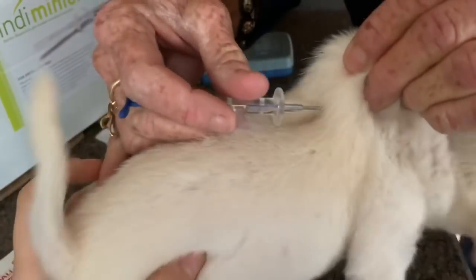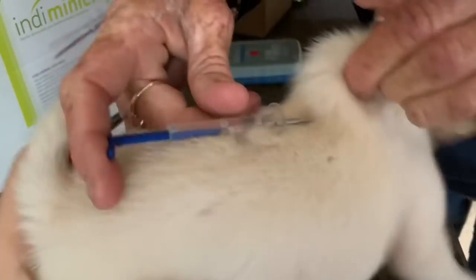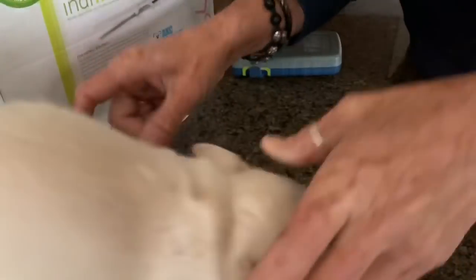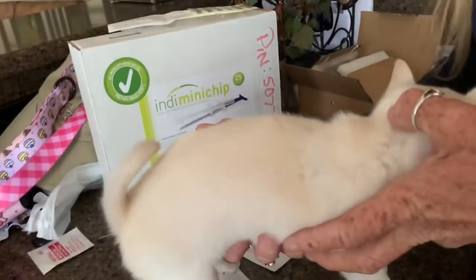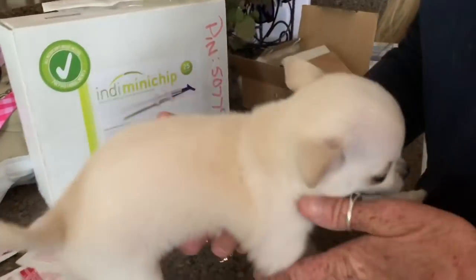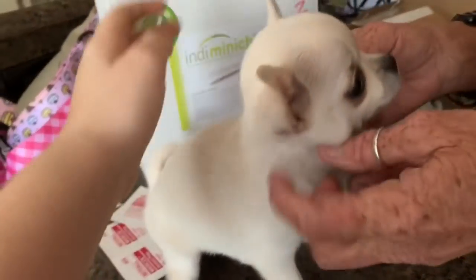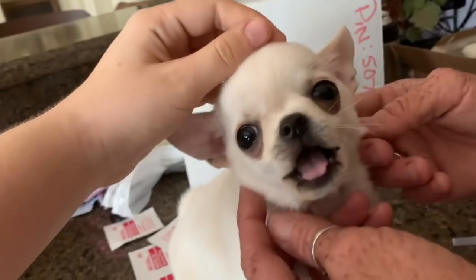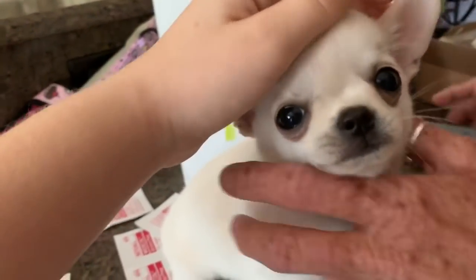He's not going to like it, and that's okay. You just keep pushing, and once you have the needle in, that's what we do. He didn't like that at all, and that's okay. They usually don't make this much of a fuss, but they can. So you want to make sure you have a good hold on them. It's like getting a regular shot when you're a baby — it's a big needle, it's uncomfortable, they don't like it. Especially when they're little fussy babies like he is.